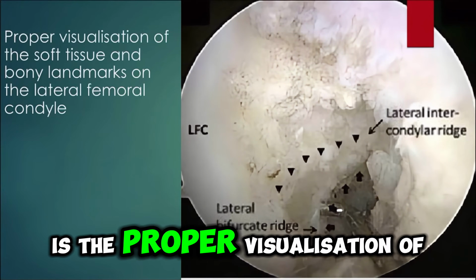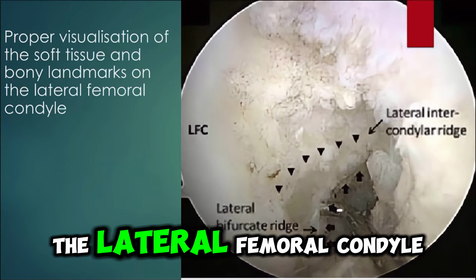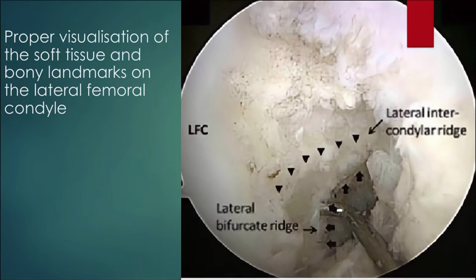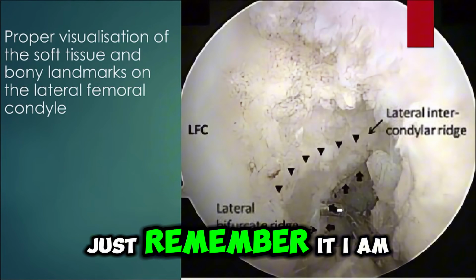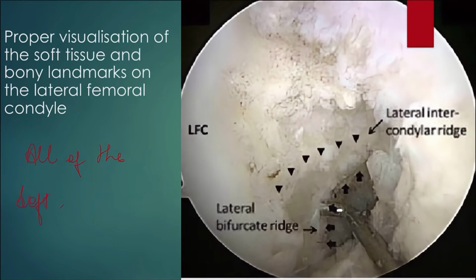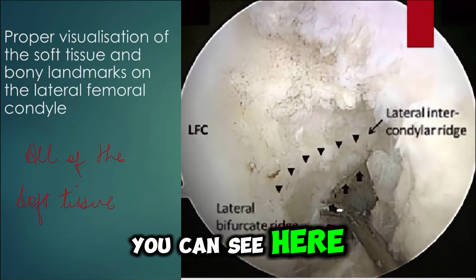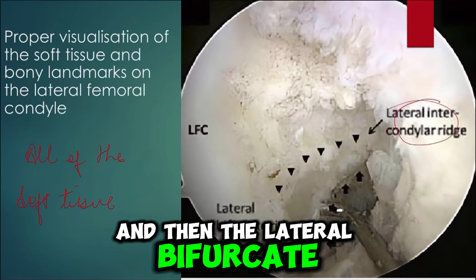First of all is the proper visualization of the soft tissue and the bony landmarks on the lateral femoral condyle. When you are doing the ACL, you have to take out all of the soft tissue. Just remember it, I am stressing it, all of the soft tissue from the lateral condyle medial wall.